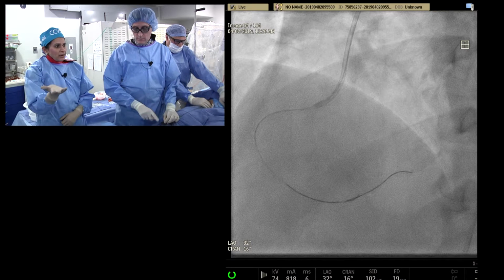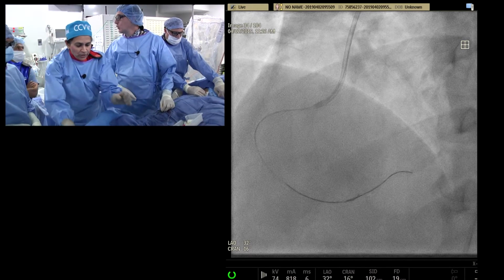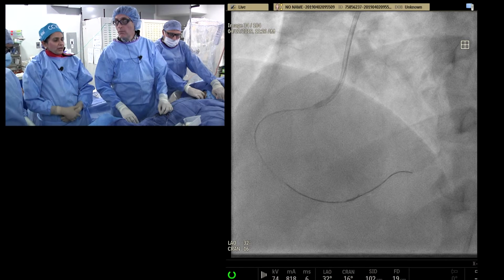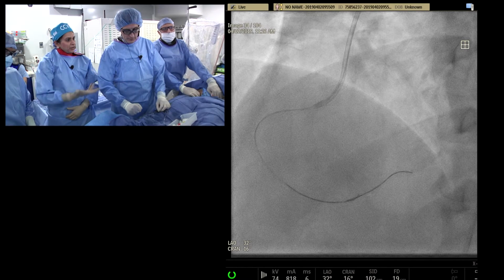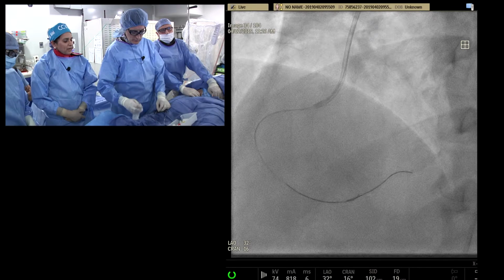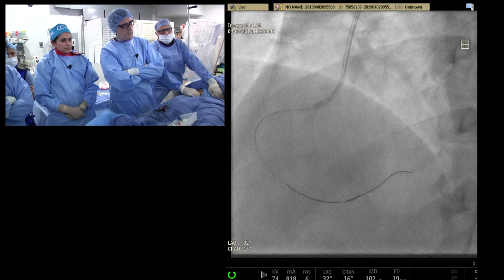So you saw the left side, it looks good. Since in between she did not have any stress test as an indication, does this right coronary artery cause her symptoms? The question also comes up, can we manage the right coronary artery disease just on medical therapy? Can we add another anti-anginal and keep her on medical therapy rather than doing more stents on this patient? So what do the guidelines suggest?